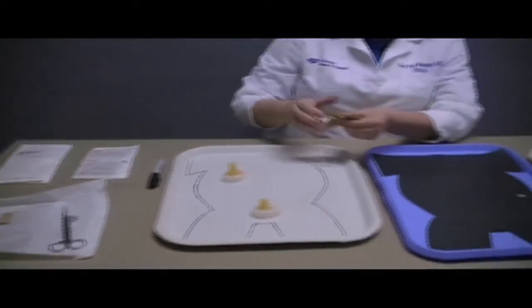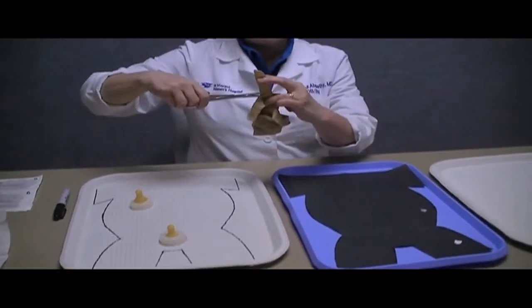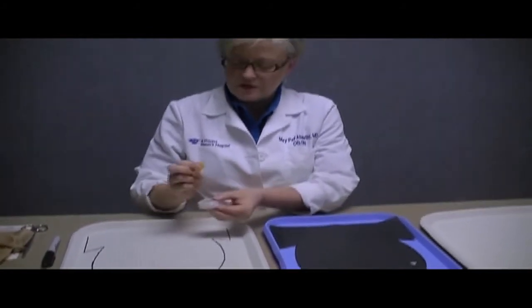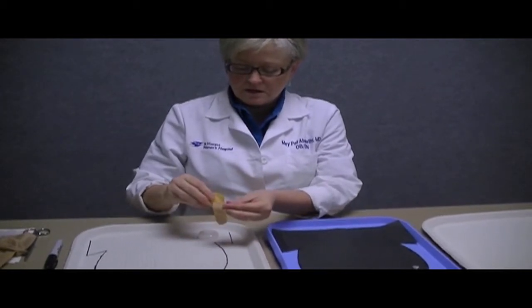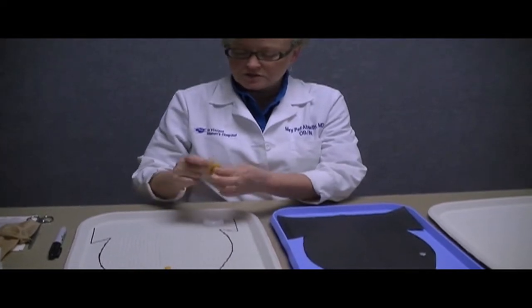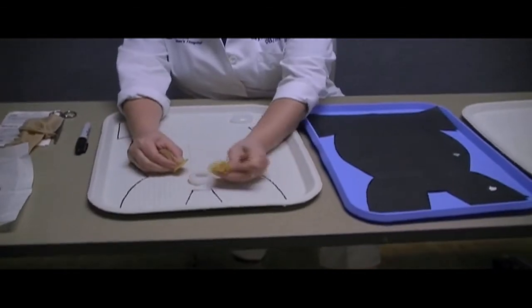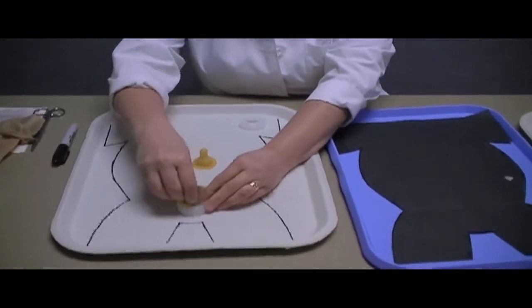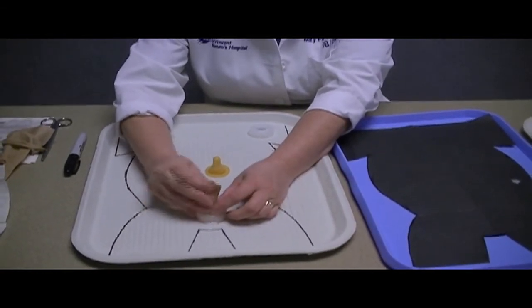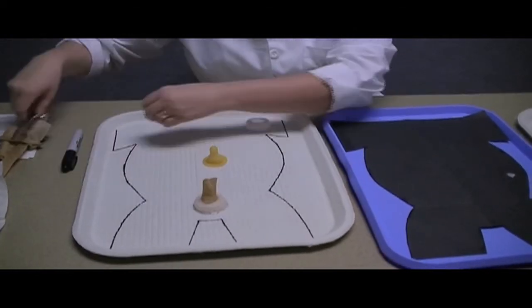We then use the glove and we'll cut off one of the fingertips like this. Take the nipple out of the lid, kind of stretch it over the indentations. Once you get it stretched over, you want to place it back into the tray. Pull it up, and then cut off the tip to create the simulated foreskin.